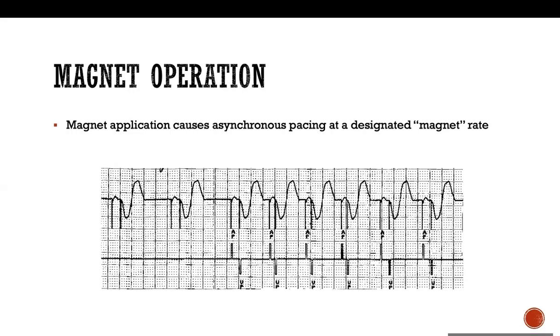Okay, so what does a magnet do in an ICD? This patient has a pacemaker. This patient has an ICD. What's the difference? I think if there is a VT storm, it is going to stop the shocking of the ICD. So it will disable shock. Yes. Okay, so you're going to disable delivering shock while the magnet is on.